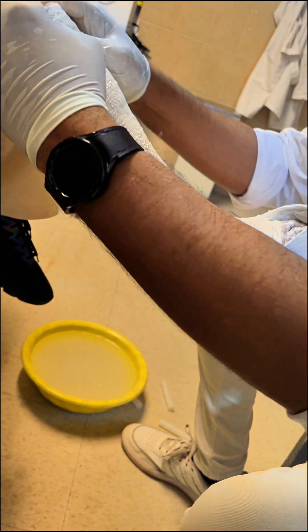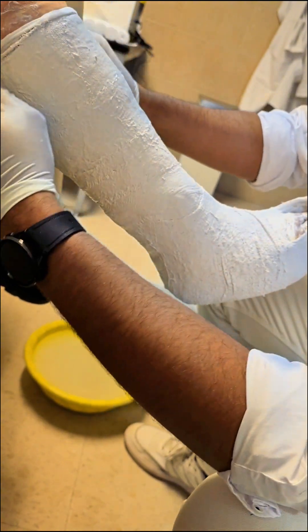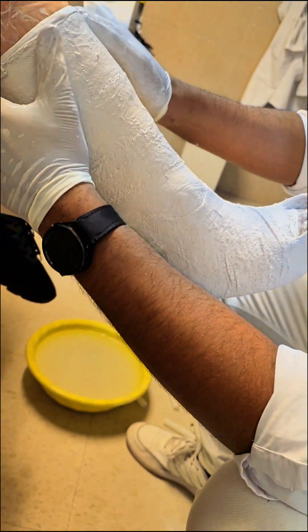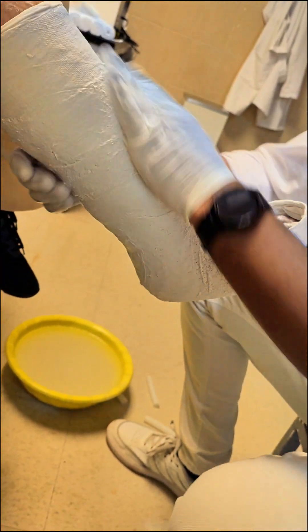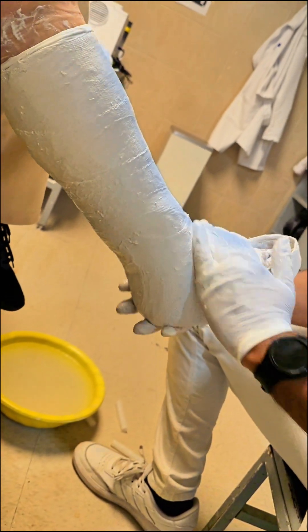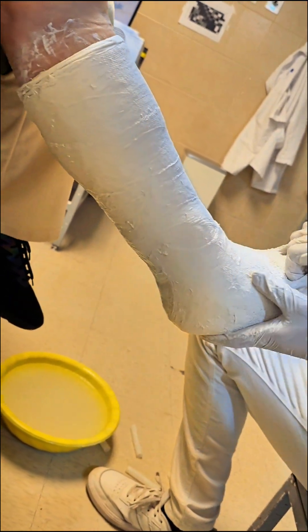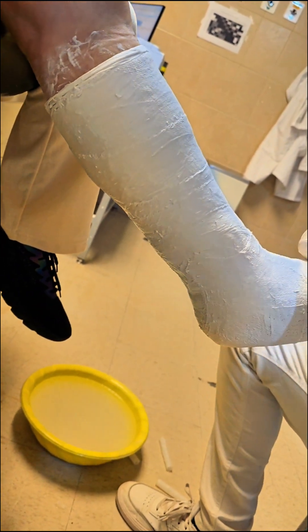Four: reinforcement. As the material hardens, consider adding an extra layer around the heel and ankle for added stability. This reinforcement is essential for preventing movement and ensuring the foot remains fully immobilized. Five: final shaping. Once the material has begun to set, carefully mold it to ensure it provides full support without being too tight. The final cast should be sturdy, providing a solid foundation for the foot to heal correctly.